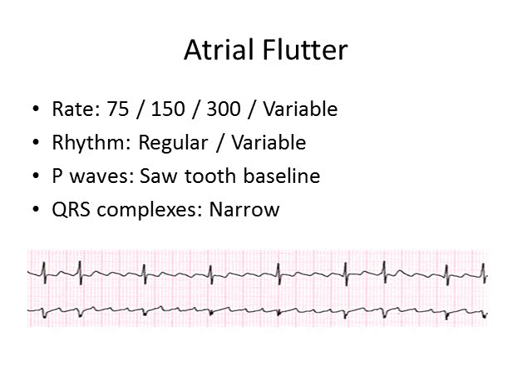The rhythm is regular but can be variable sometimes, but the main thing to see is this sawtooth baseline. As you can see, it's a very consistent baseline. And if you remove the QRSs, as is done here, then you can see that the wave is very consistent. QRS complexes are narrow. Again, if you think about the structure and the anatomy of the ventricles, it's exactly the same as it would be in a healthy person.